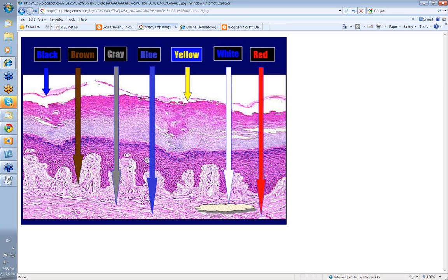Yellow is usually due to serum or even some keratin in the very top layers of the skin. White is usually due to collagen down in the dermis. And red is due to blood vessels deeper down. So color is related to melanin, to collagen, to blood vessels, and sometimes to surface secretions, and the depth of where they are gives you the color that you see.